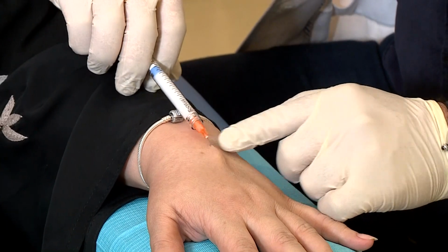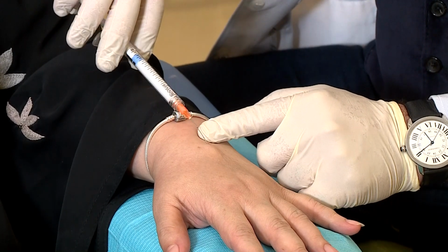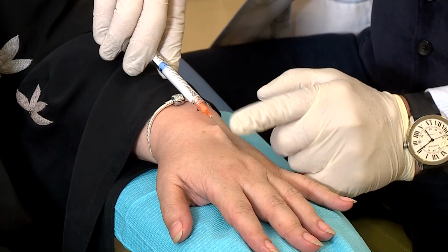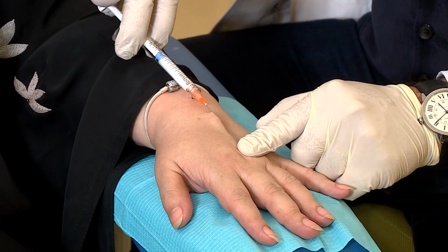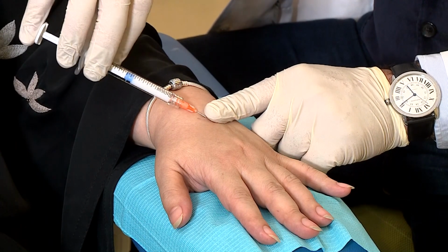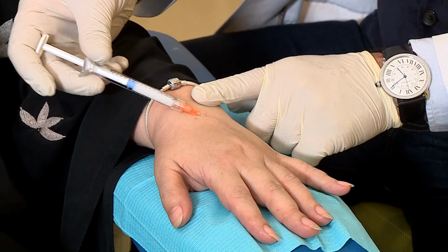Fanning technique is fine as well, as long as you can look at the tip of your cannula and know exactly where you're injecting. The pain usually is minimum. A little bit of discomfort. Patient expectation after the procedure: a little bit of swelling, maybe for 24 hours or 48 maximum. Bruising is rare because the blunt cannula is pushing the blood vessel away, as you can see from here.